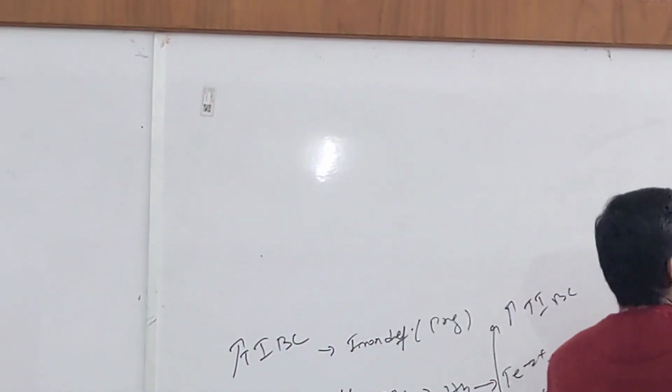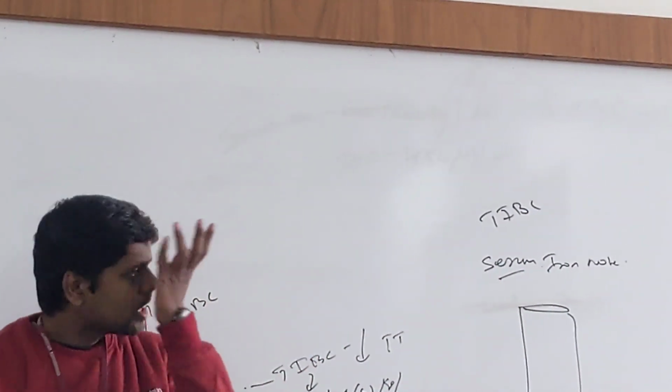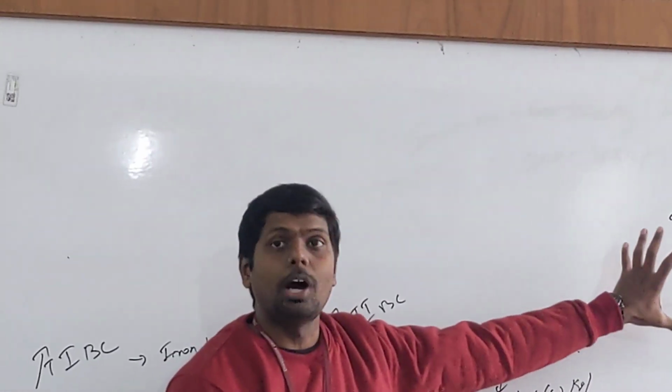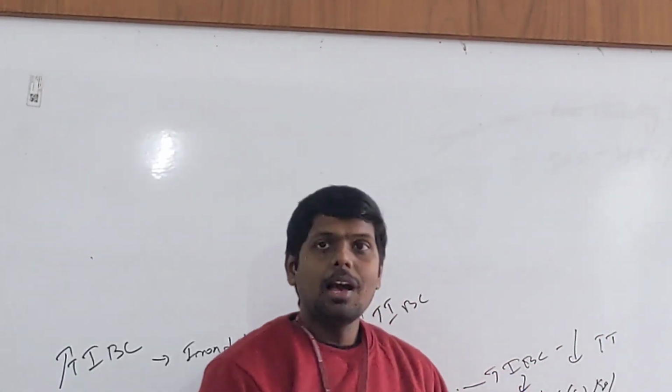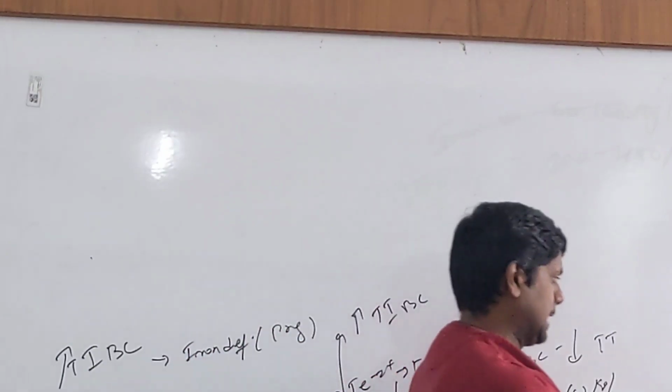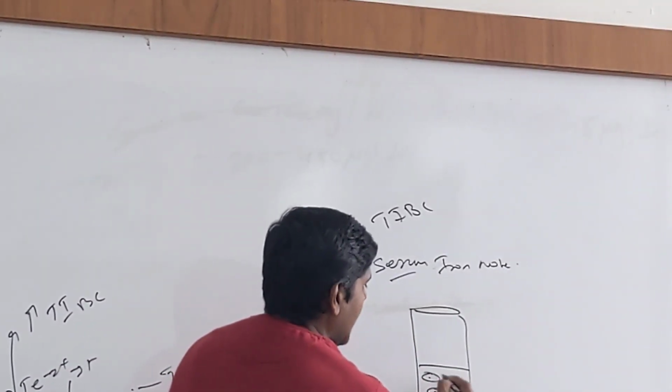So I'm going to perform the TIBC test here, the total iron binding capacity test. I want to evaluate the total iron binding capacity in the body. I know that in the patient serum, I have transferrin molecules.